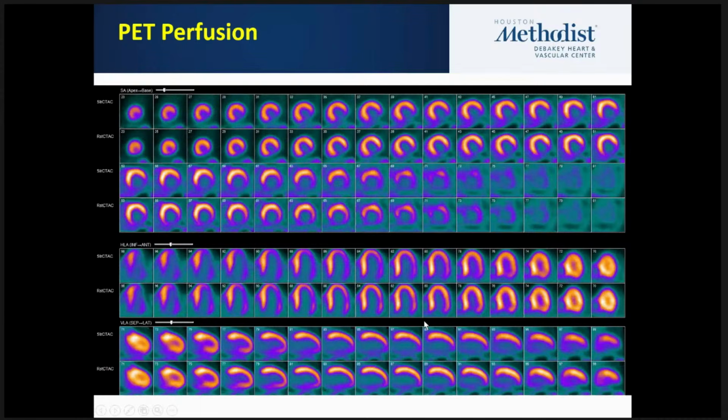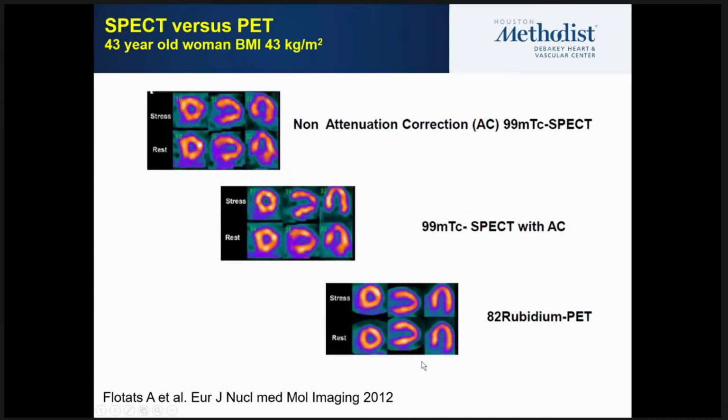This should be a full donut if it was a normal study, like what you see here, this is a full donut, so it's a normal study. You don't see the full circle, and there are decreased counts in the inferior inferolateral wall, a little bit more on stress compared to rest, which makes somebody think this is a fixed defect, and probably some people will call it a scar.